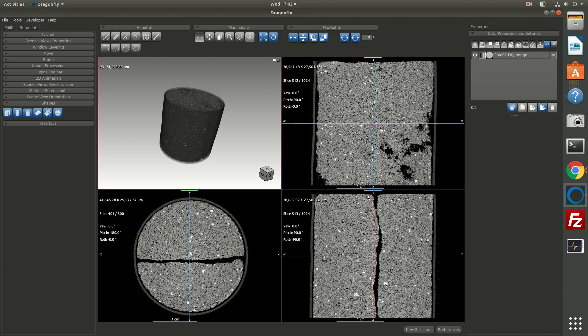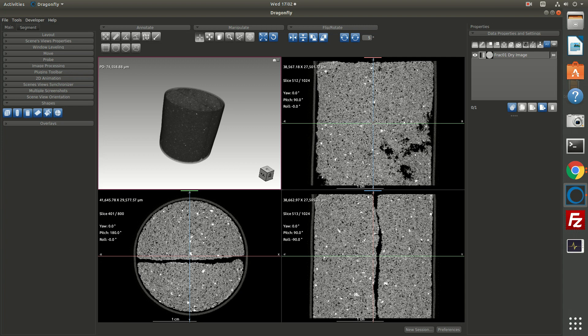We have the Berea sandstone fracture sample from the Digital Rocks portal, and in this video we're going to look at a few tools associated with image segmentation. We're going to look at tools for ROIs, or regions of interest, and tools for shapes, namely the cylinder tool. And we're also going to look at how you would compute a thickness mesh.